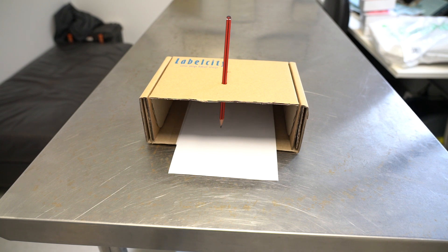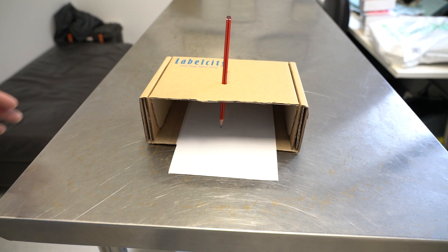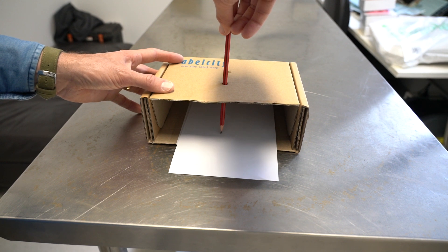So with this demonstration I've taken a pencil and put it through a hole in a box and what we'll find is that the movements that are made outside the box are reversed and upside down on the inside of the box.